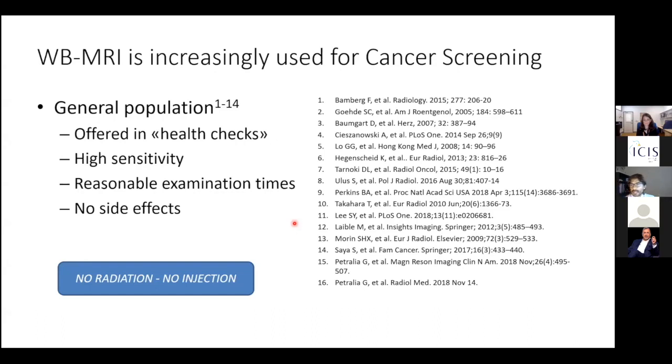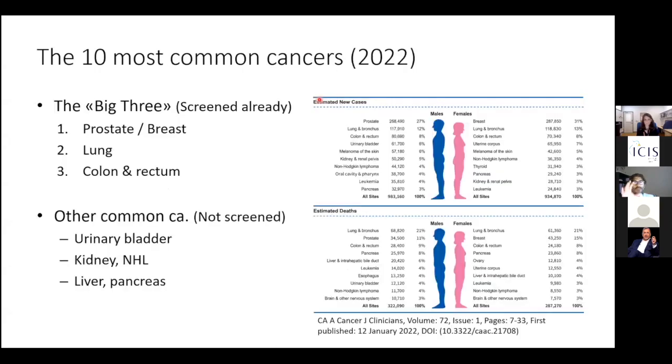And as you can see here on the right on the screen, there are more publications on the topic than you can imagine. And what are the targets? What are the cancers that can be screened with whole body MRI? Here's the list, the cancer statistics of 2022. So this is the top 10.